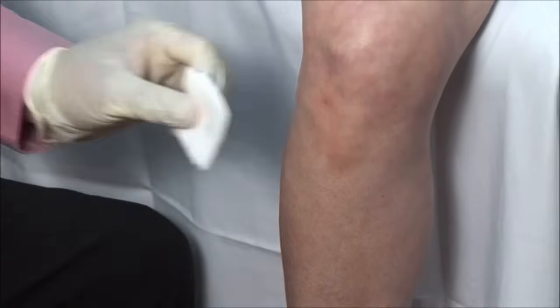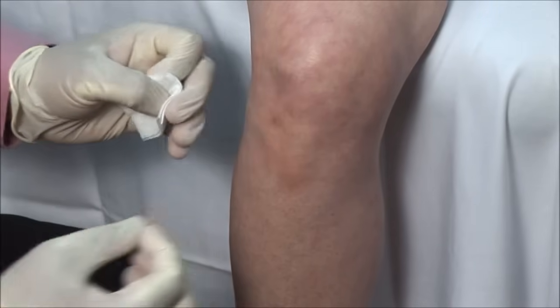Finish off by drying the site and applying a bandage.